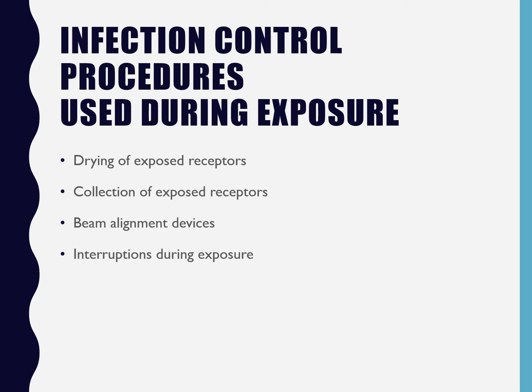The collection of exposed receptors. So, if you're using bite wing tabs or things like that, you're going to have to keep those. You have a little garbage container by where the computer is, and that way you're able to keep control of those kinds of things.